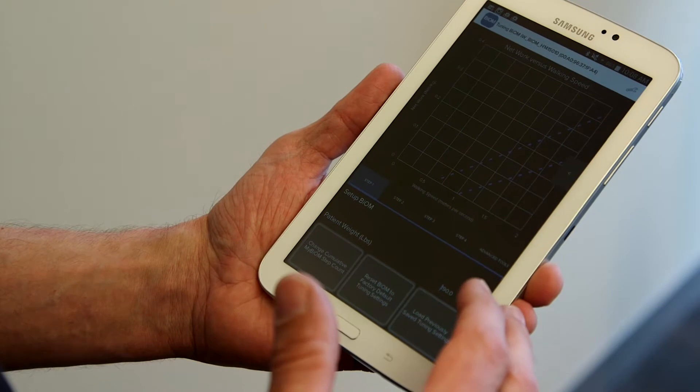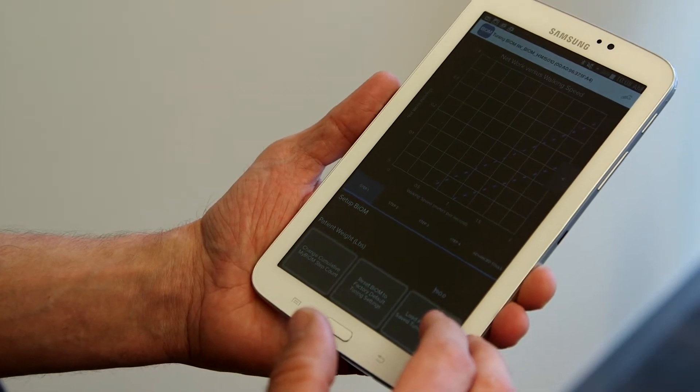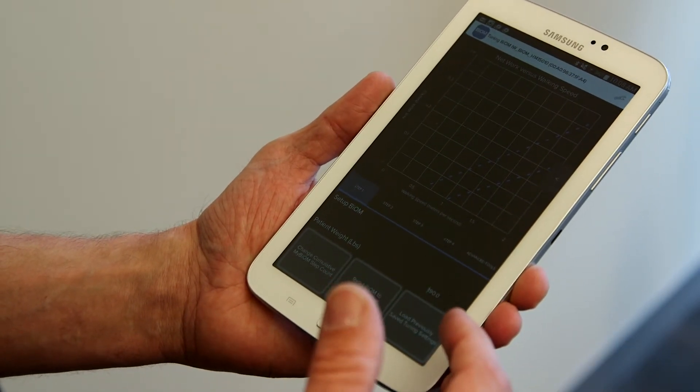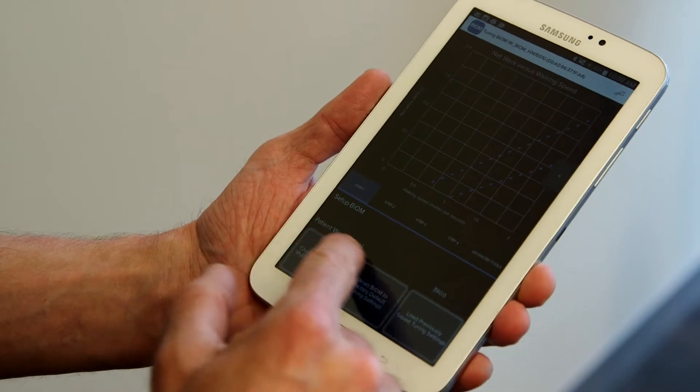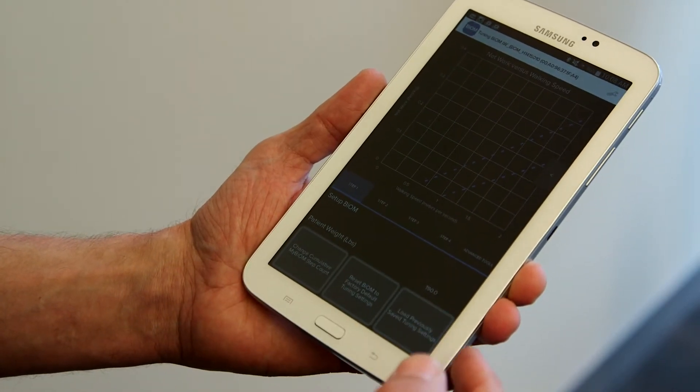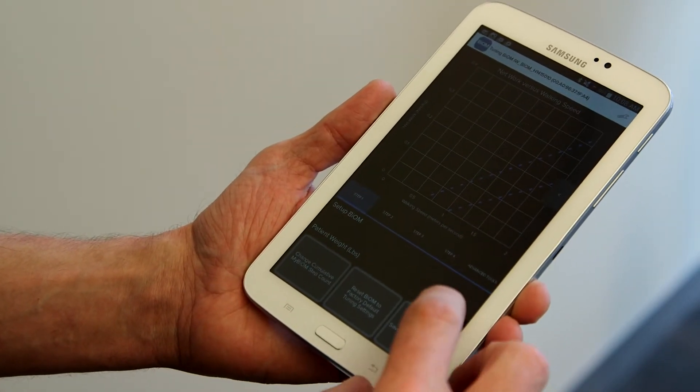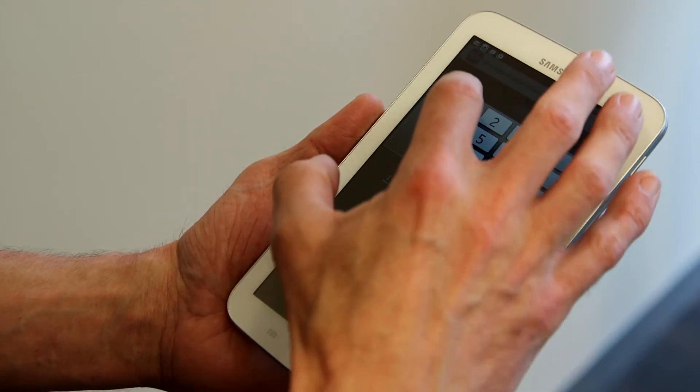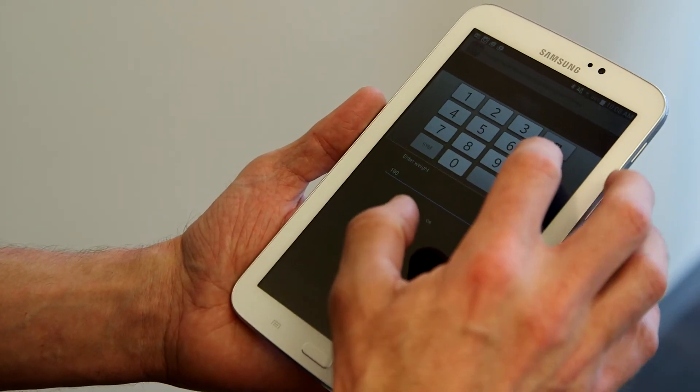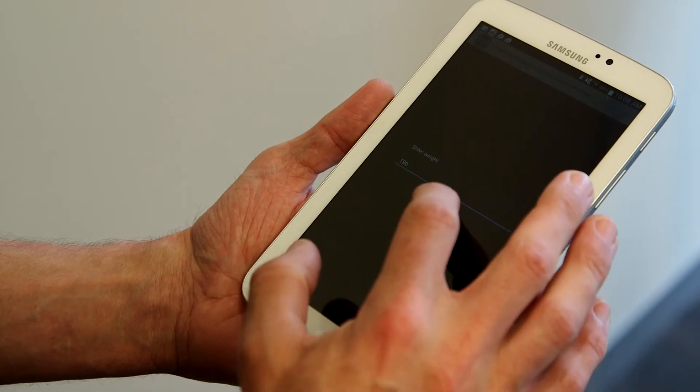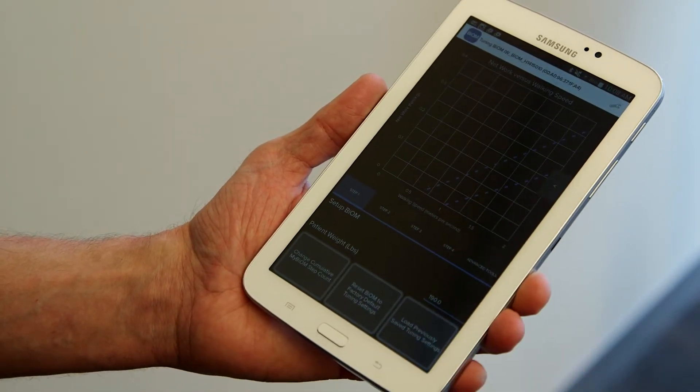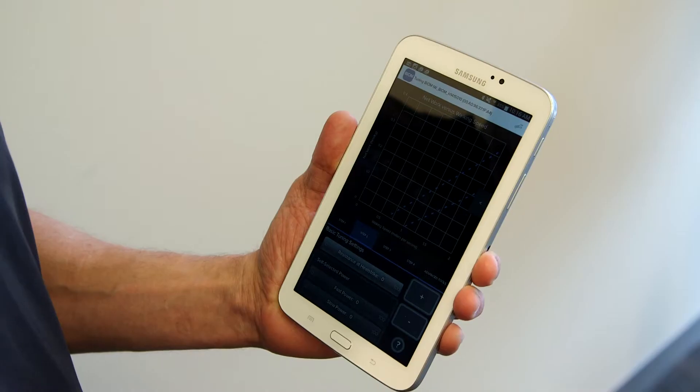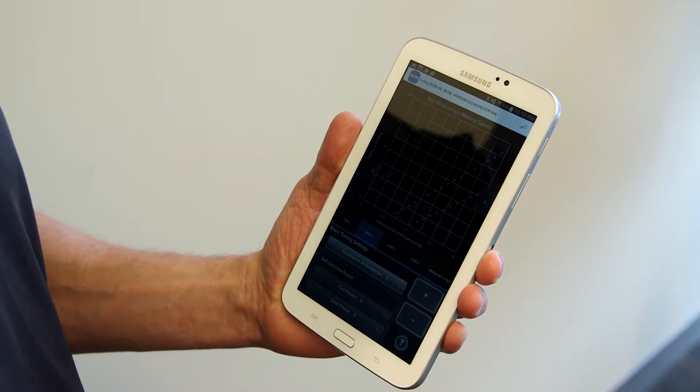Step one represents, or will ask us to input the patient's body weight, and we see the patient weight input towards the bottom of the screen. I can touch that and enter the patient's weight, and we'll see that entry there.